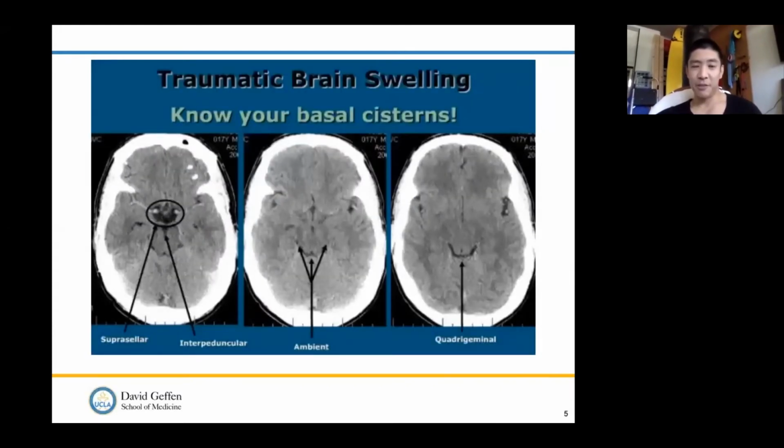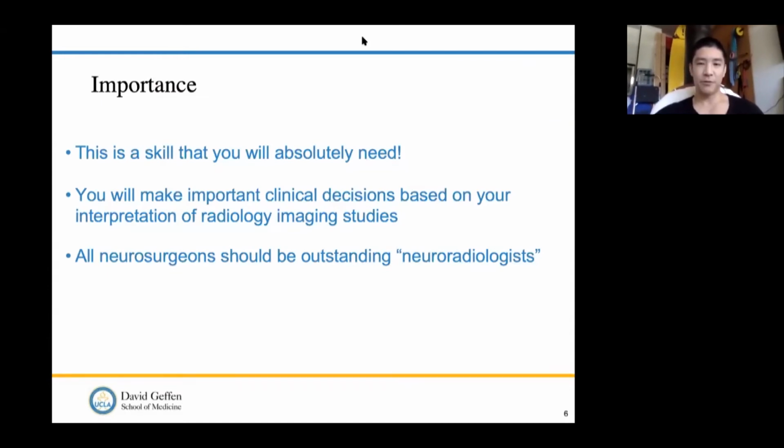For sub-Is, in terms of acute conditions, basal cisterns, and it's great that it fits in with what Juan and Dr. Bergschneider mentioned, but basal cisterns, you look at those and you'll save somebody's life. I'm going to turn it over to Dr. Colby, and I can just advance the slides for you if you want.